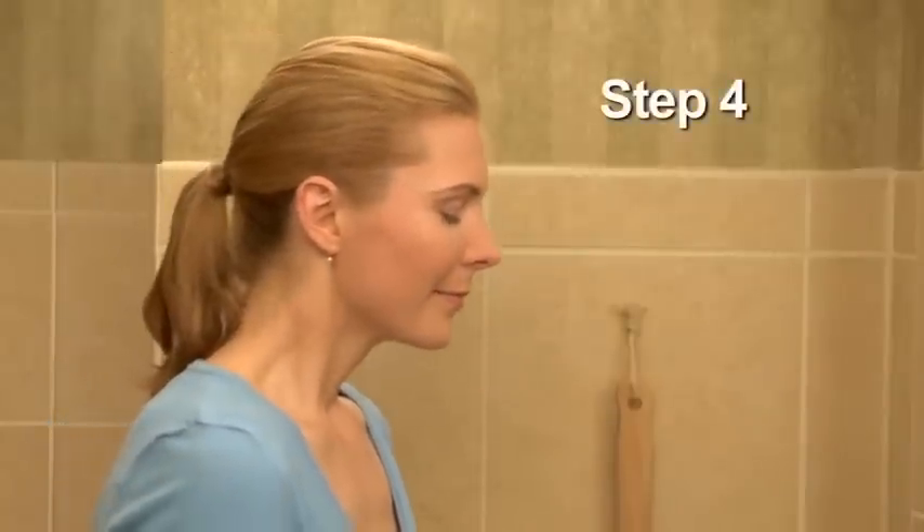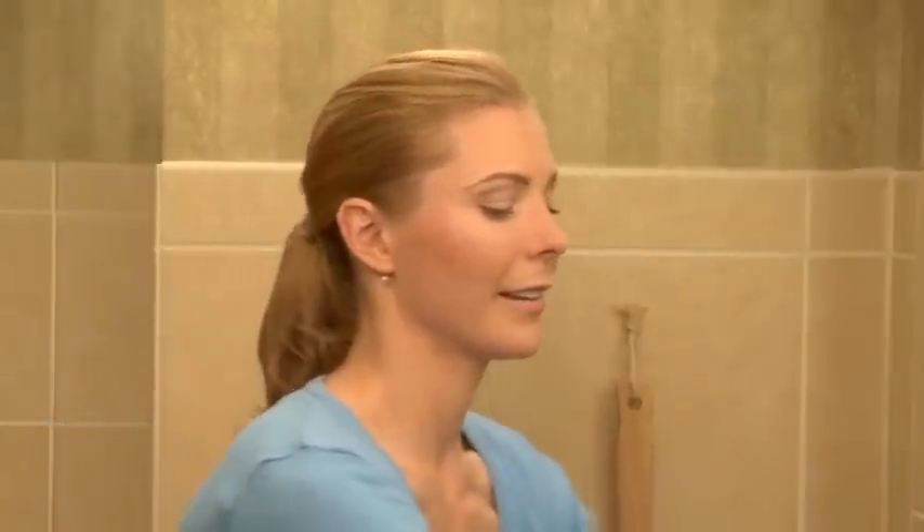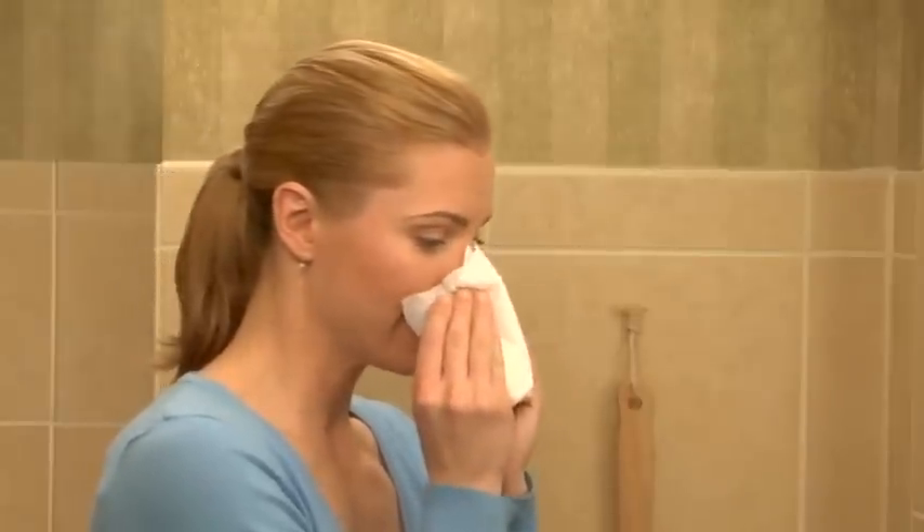If tolerable, sniff in any leftover solution remaining in the nasal passage once or twice before blowing the nose, because this could clean out the back airway. Blow your nose gently, without pinching your nose completely, because this will create pressure on the eardrums.